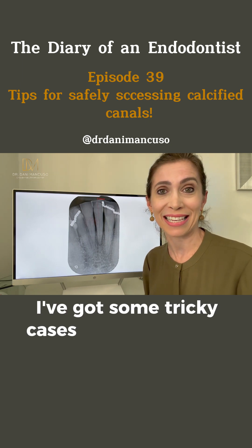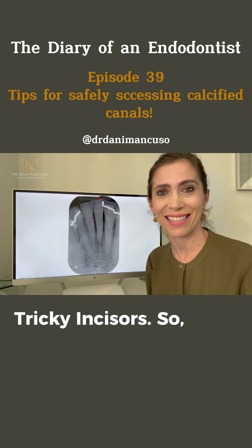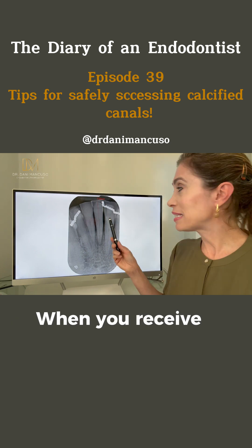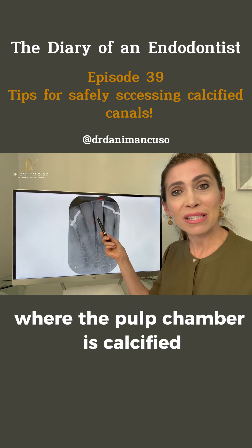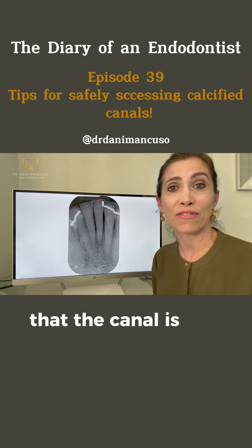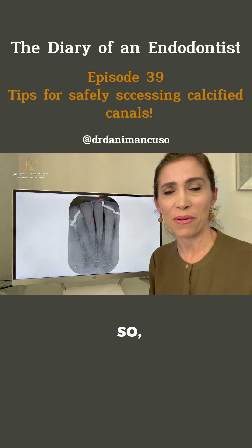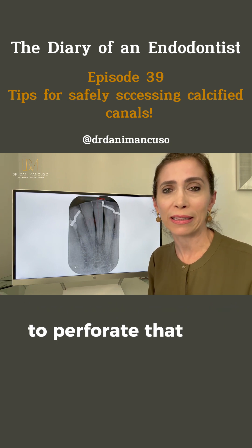I've got some tricky cases that I call in my lecture 'tricky incisors.' The tricky part is the access cavity. When you receive a tooth where the pulp chamber is calcified, or it looks like in the x-ray that the canal is very narrow, but in reality when you access you can't find that canal — those are the cases that can be quite tricky and where you risk perforating the root.